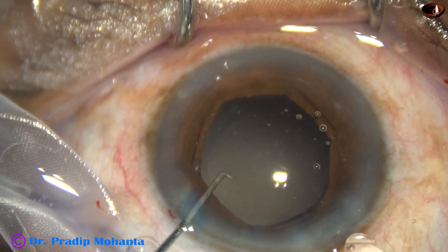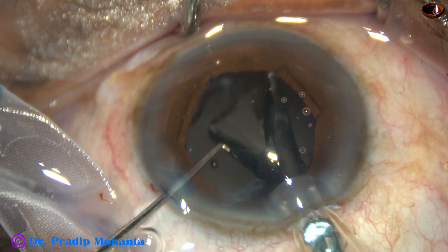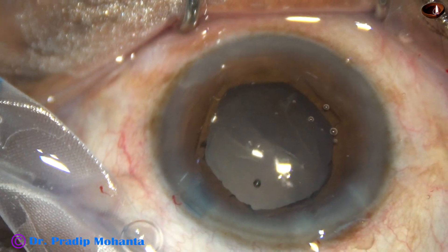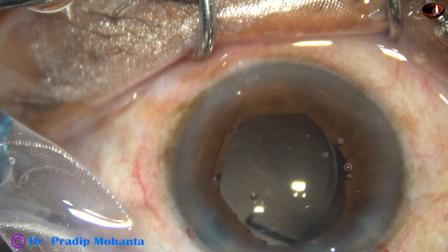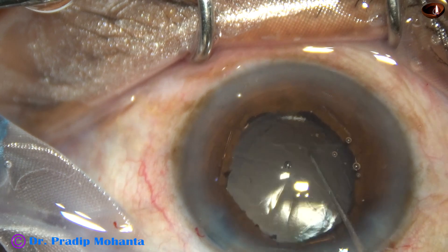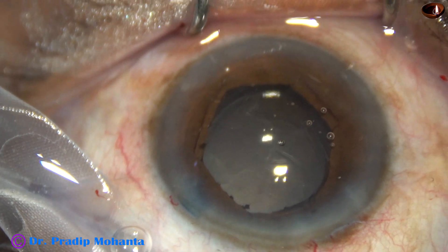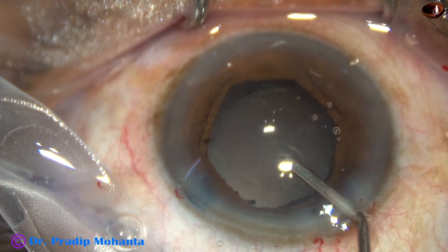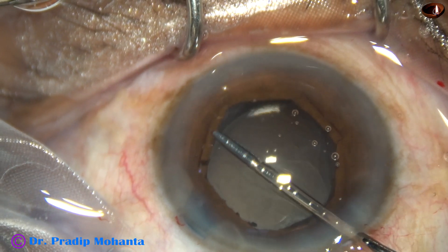A single piece monofocal intraocular lens is being implanted in the capsular bag. The lens is dialed in such a way that the haptics are about 90 degrees away from the main incision. This is because I want to go behind the lens to remove the visco from the capsular bag. If a haptic is just in front of the main incision, it becomes cumbersome to go behind. So the haptics are about 80 to 90 degrees away from the main incision.